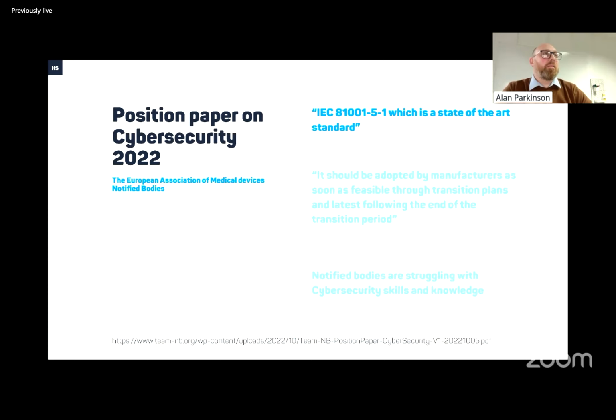Yeah, so just to clarify, Annex 1, it mentioned security 6 times, but Heather's completely right. On manufacturing, it only mentioned it once, and 3 of the other times it mentions security is actually on intended use and labelling. MDR was very much focused on pre-market, and didn't even think about post-market surveillance, but that has changed with advice that's been issued since then.